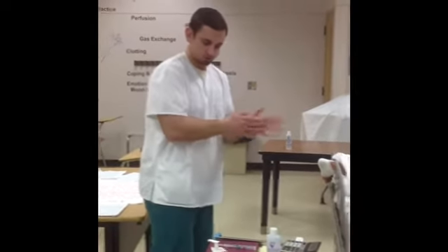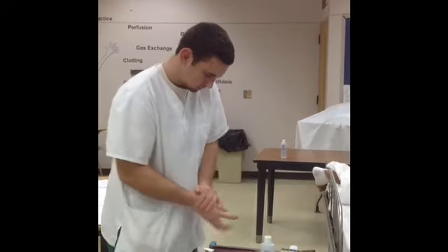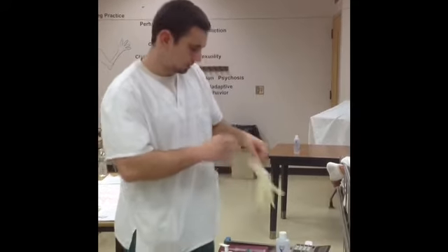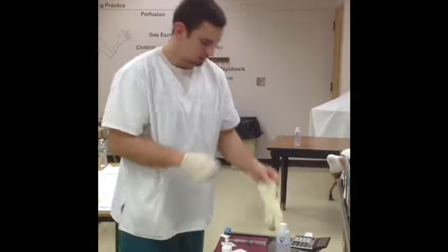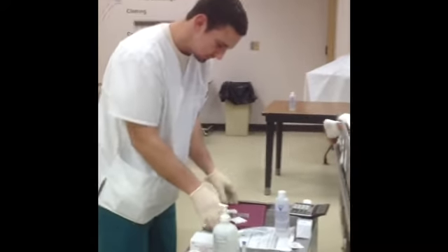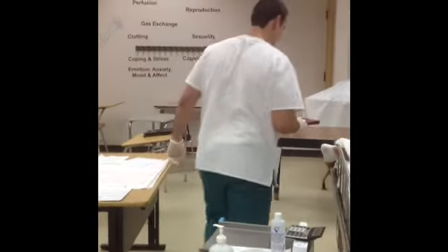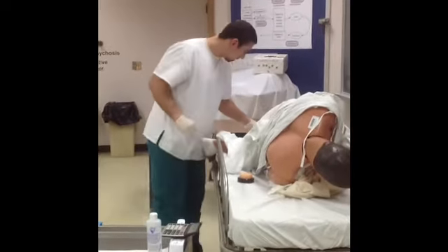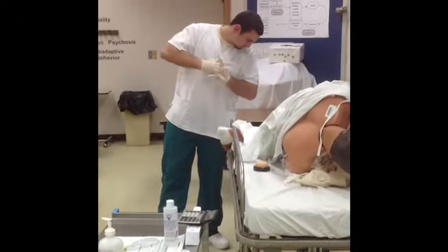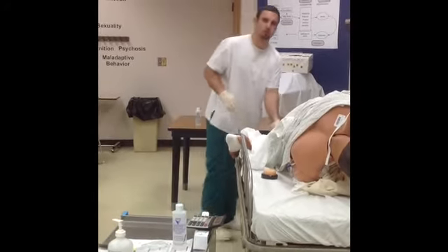Hand hygiene is very important. Put on some gloves. Alright, so I'm going to get all my supplies. Alright, over here. So I'm going to locate the ventrogluteal site. So I'm going to come over here.